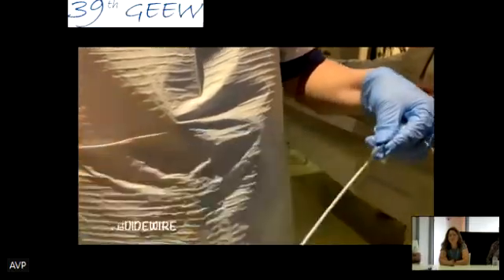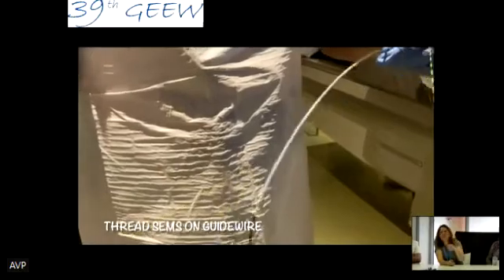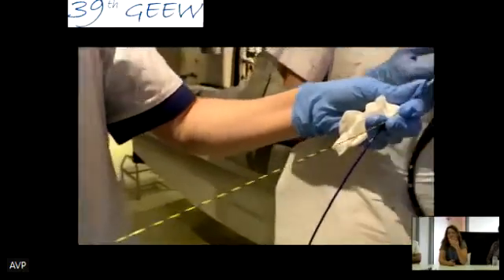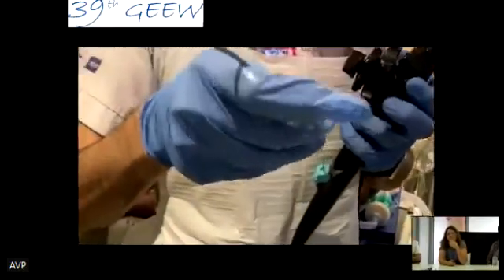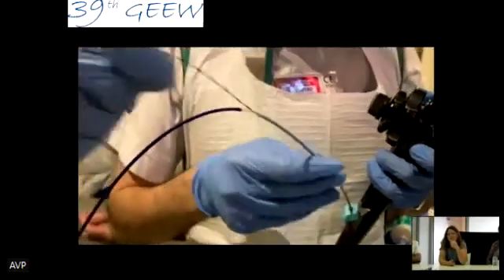With most of these metal stents, you will see that the guide wire goes out there, so you cannot give a lot of force to help the physician push in the stent. There are some stents that can still be put in long, but we don't use them very often. We just use them if we really need a lot of force to go up.